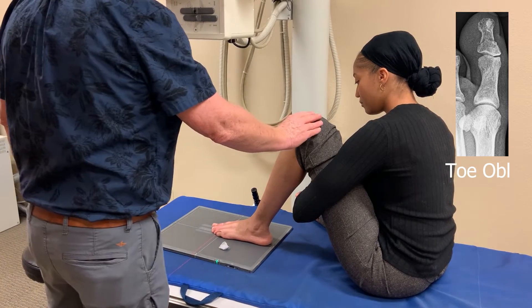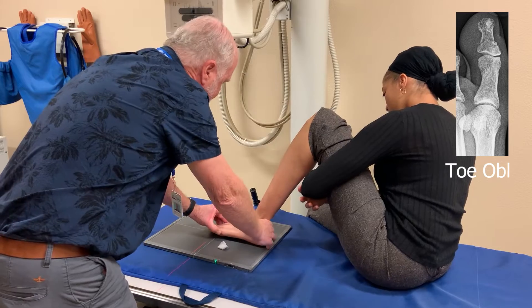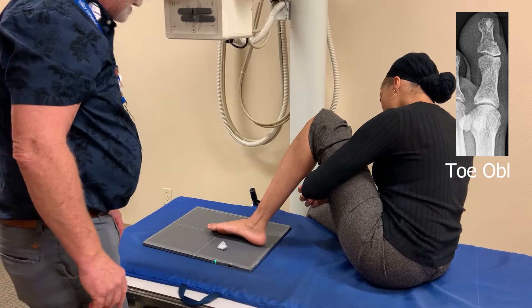Our oblique is pretty easy. You have the roll of the knee inward, just like we do on the oblique foot. Let the foot roll up a little bit. There's our oblique. If we don't roll up too far, we're probably not going to superimpose these other toes over that second toe.